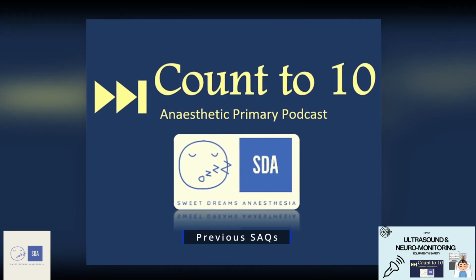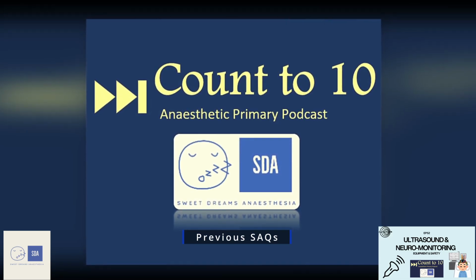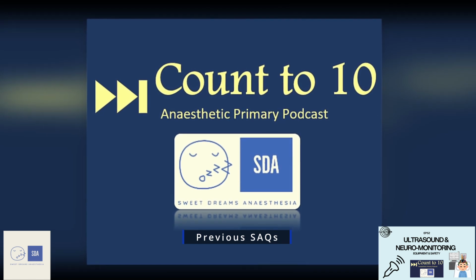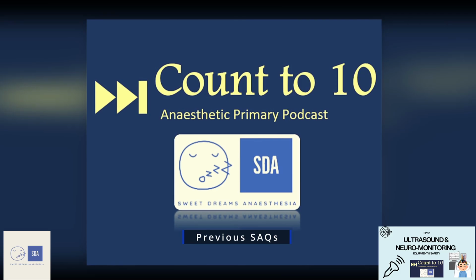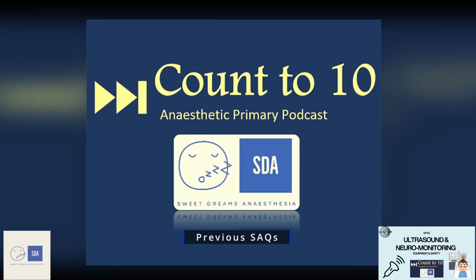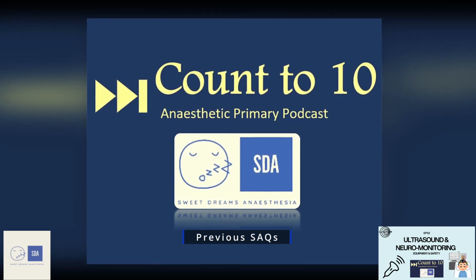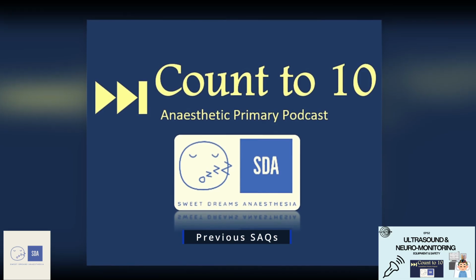The last thing I would put in with clinical application, if you had time, is that by understanding what happens at different tissue boundaries, such as the pleura and the parenchymal lung, we can use this knowledge to identify certain clinical states. And the example here is seeing the pleura sliding across the lung when the lung is inflated, and when you have a pneumothorax, the pleura would not be sliding.